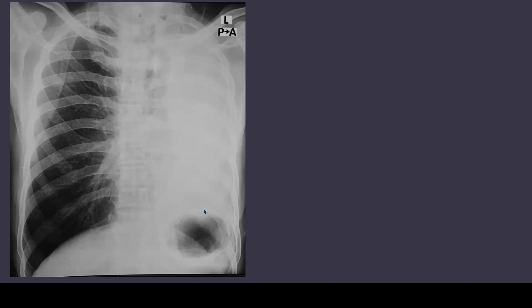Whenever you see this white opacification on a chest x-ray, the next step is to look at the position of the trachea, as the tracheal position will help you in understanding or coming to a diagnosis. If we look at this x-ray, we can see that the trachea is shifted towards the left side, towards the same side where this opacification is.